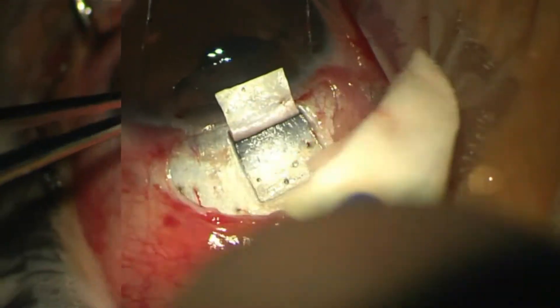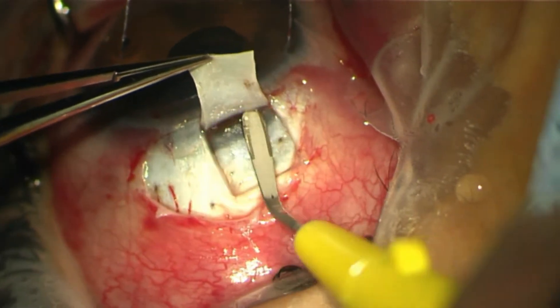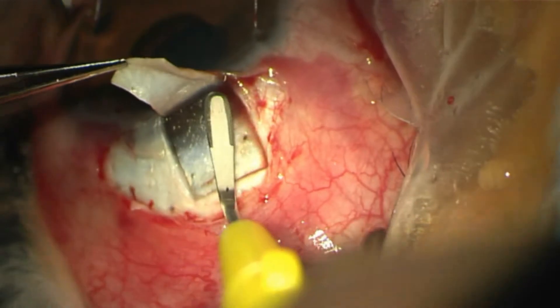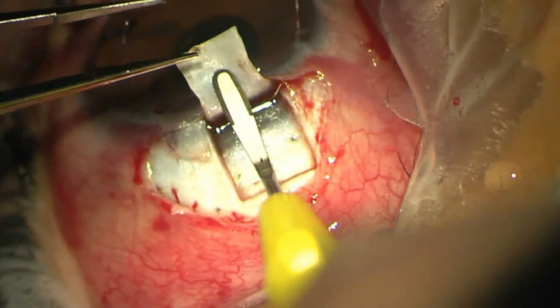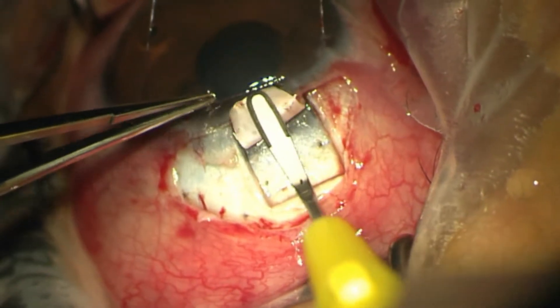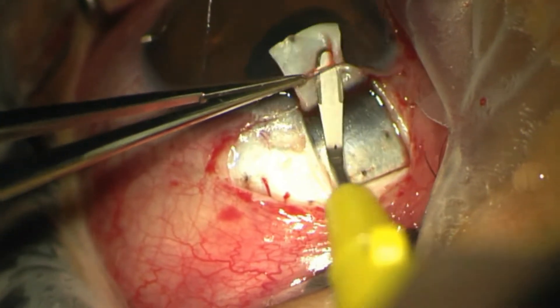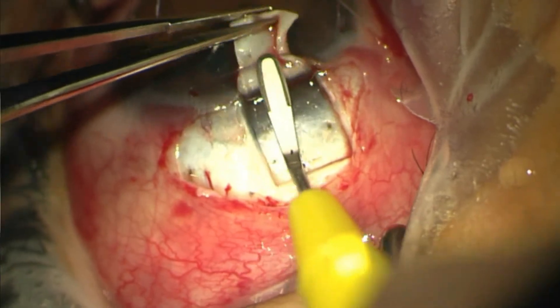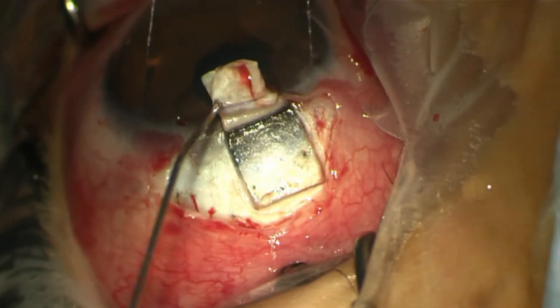We then irrigate the area with balanced salt solution and keep it dry afterwards for further dissection. The superficial flap has to be advanced towards the cornea by about one or two millimeters.